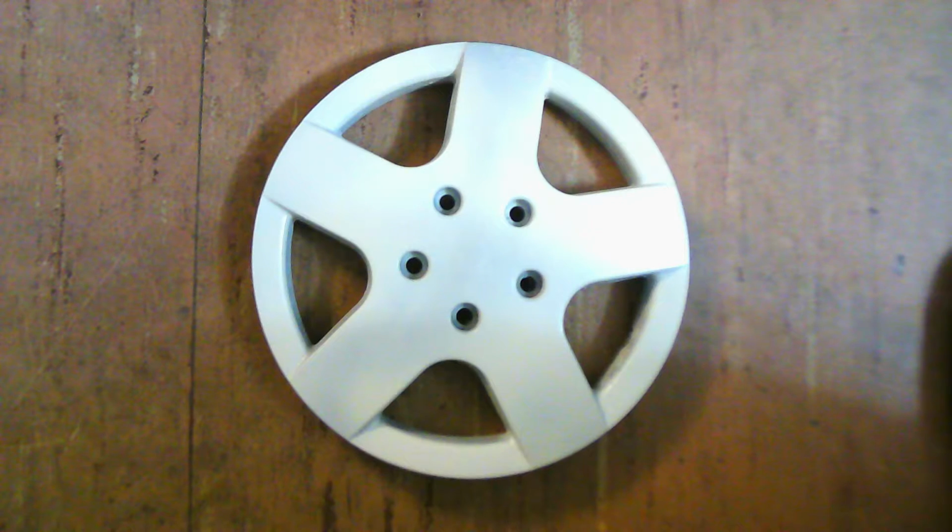This is a look at the hubcap after the primer was applied. All that matters to me is that the primer is applied to the metal. I'm not looking for a finished or polished look with the primer.